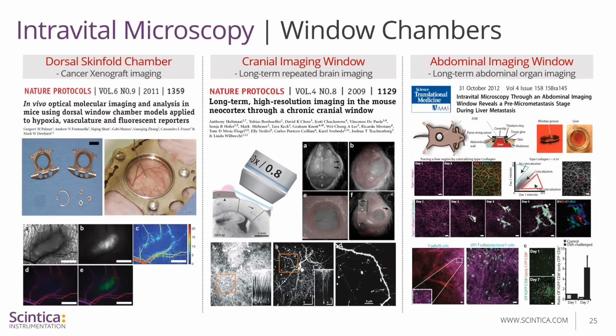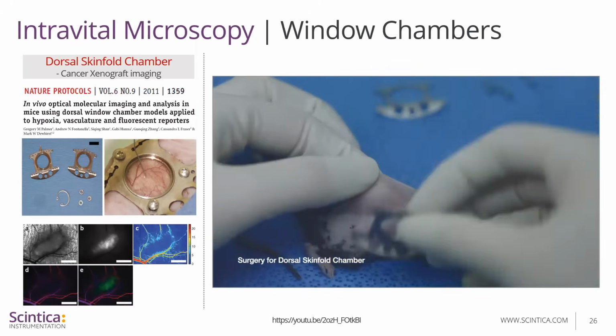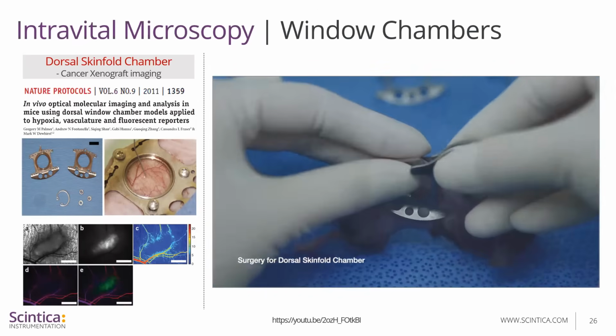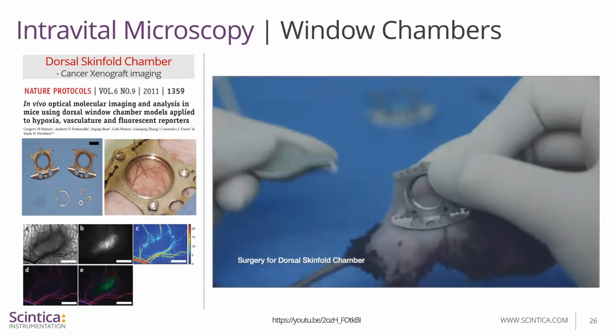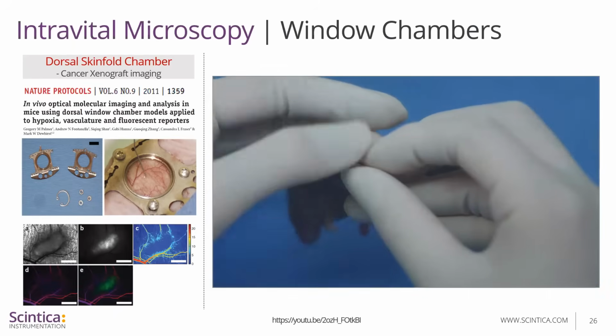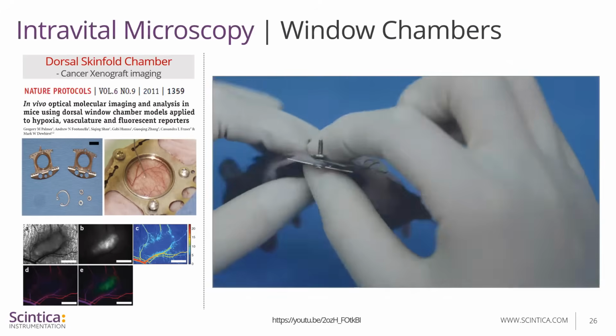Nevertheless, creating your own intravital model will take a fair amount of time, dedication, and skills. I will now play a video of the installation of the dorsal skin fold chamber, which is one of the most characterized window chambers out there, so that you can get an appreciation of the complexity of a surgery, this one being one of the easier surgeries.